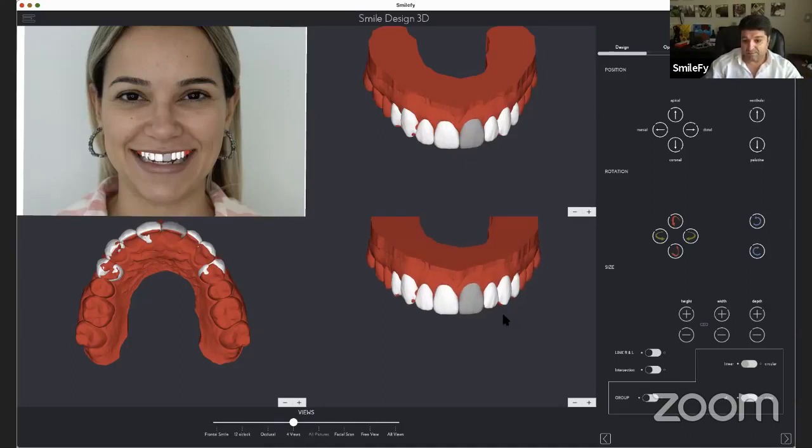Giving the patient the option to have a mock-up at the first appointment, with all the procedures, with intraoral scans, with picture taking and so on, in half an hour. Of course, it's a beautiful, different workflow and idea. Idea how to create this motivational part for the patient.